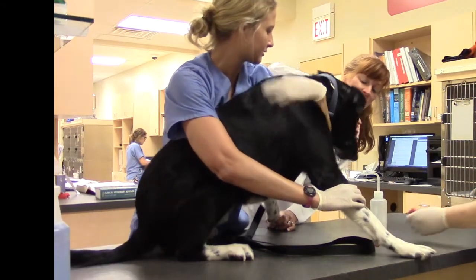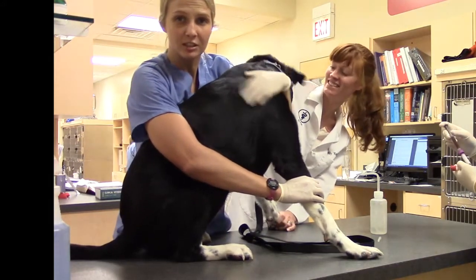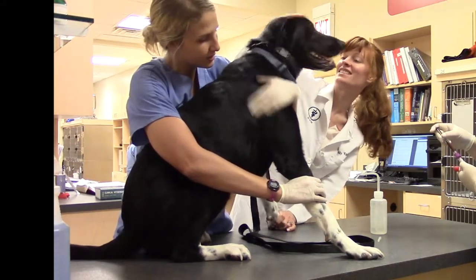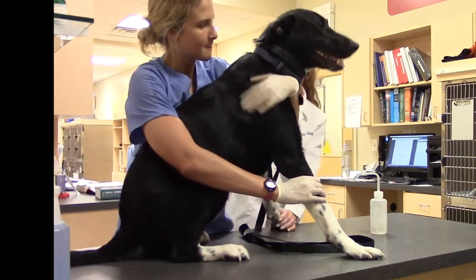Over it, over it, over it. Great job! You did it! And we're just going to keep holding off to make sure there's no hematoma. That was so scary! You did very good! That was so cute!